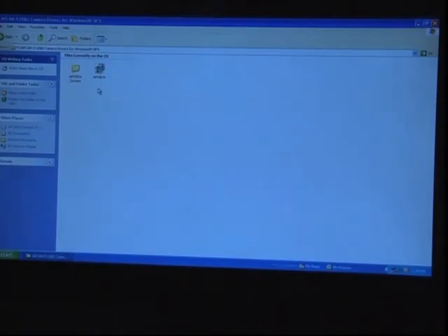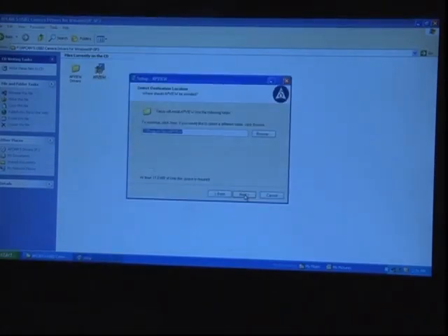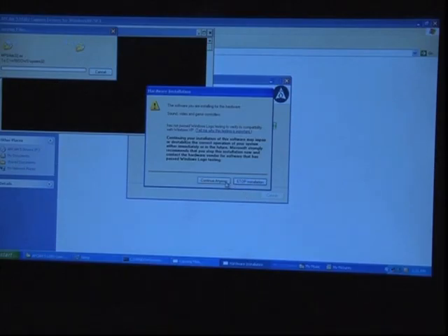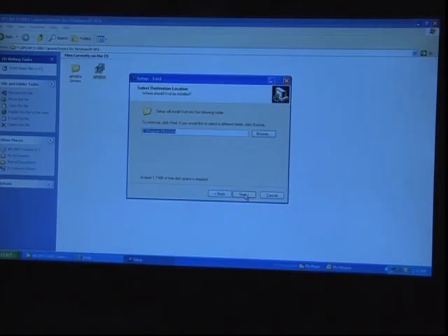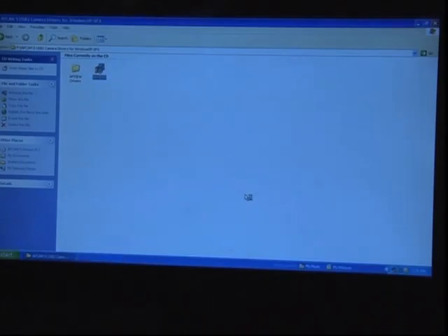As our OS is Windows XP, we enter the Windows XP folder. We go to the .exe file on the right-hand side and press Next. It extracts files and installs the software. Clicking 'Continue Anyway,' we accept the agreement, press Next, choose the path for the folder, click Install, and finish the installation. Now we have the software successfully installed on our desktop.